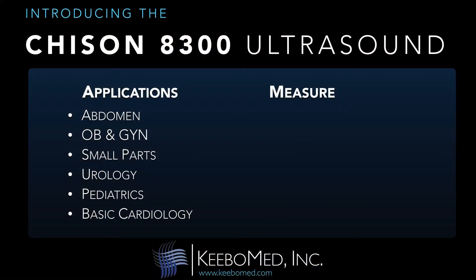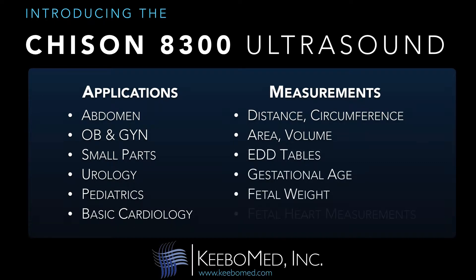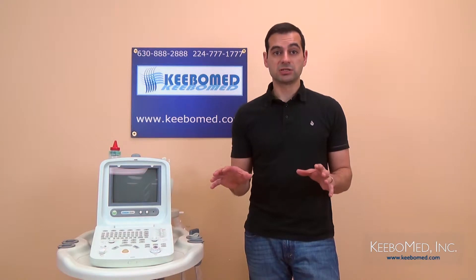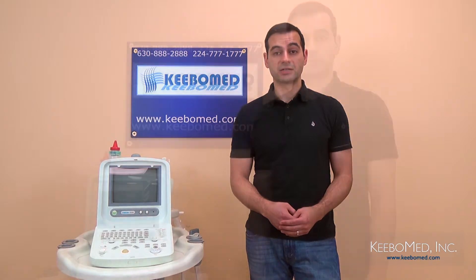Some of these abilities include distance, circumference, area, volume, EDD tables, gestational age, fetal weight, and fetal heart measurements. Specific report templates are also installed. These various applications and extensive software of this system allow for much flexibility in your practice.